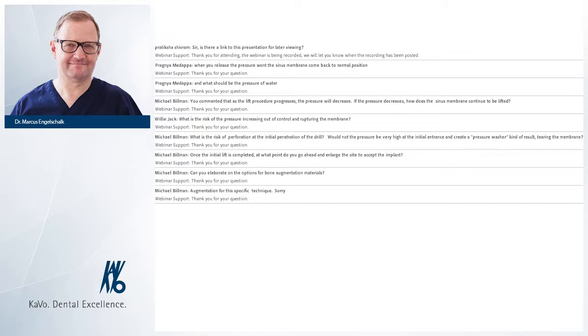I hope I got them all, the questions. Well, the first is a link to the presentation. I'm not sure. We have to talk to Dental Tribune. The diameter of the drill I use, yeah, it's very small. It's 1.2 at the beginning. It's very, very small. And then you're spreading up. But you use the drill given you by this YEDA system, because it's well calculated. They have their own drills.